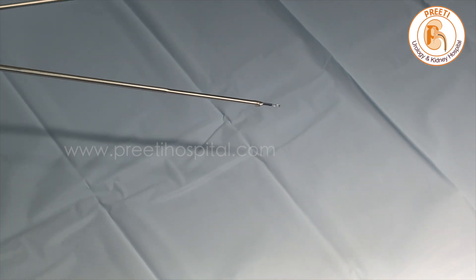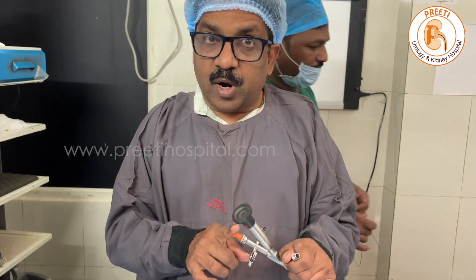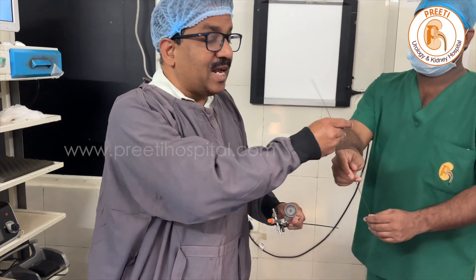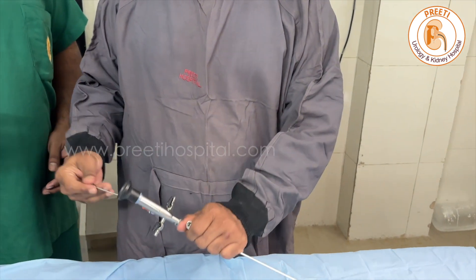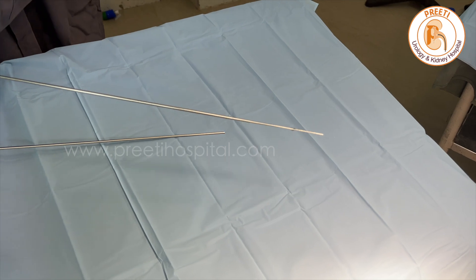This is very useful. You can hold it and come back. So one guide wire 0.025 goes, one end circle basket goes, and the pneumatic lithotriptor moves front and back, so you can break also.